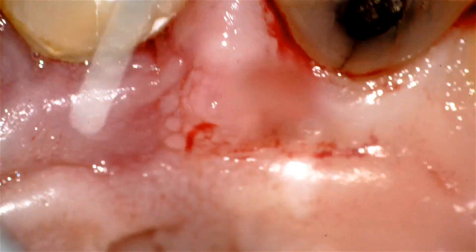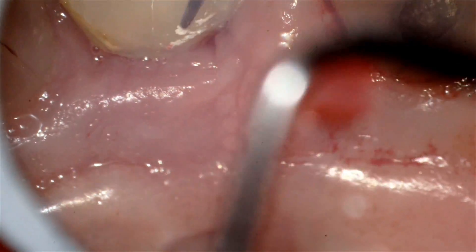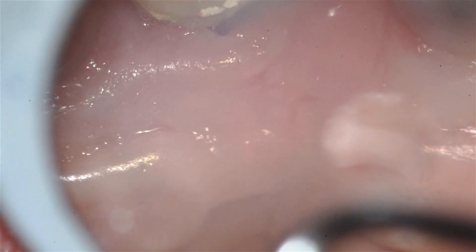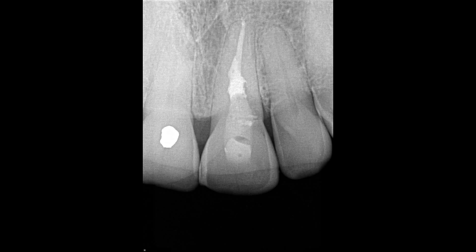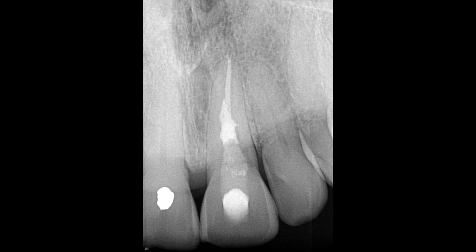Now, the hygienist will have to be instructed on future cleaning visits not to go in and gouge and try and remove irregularities in the crater, but quite frankly, after looking at these cases and following them for several years, the Biodentine is very stable. This tooth should serve the patient very well for many years.